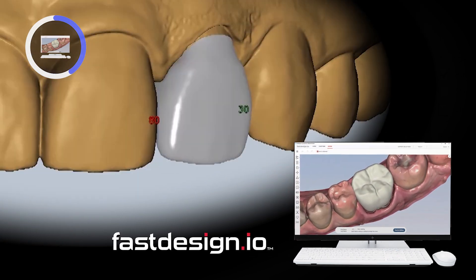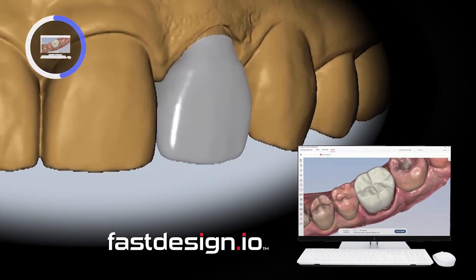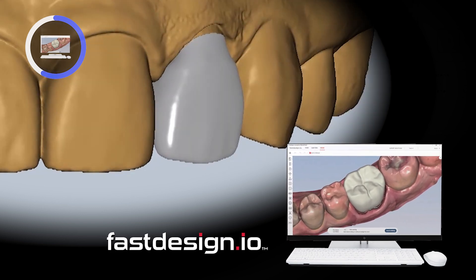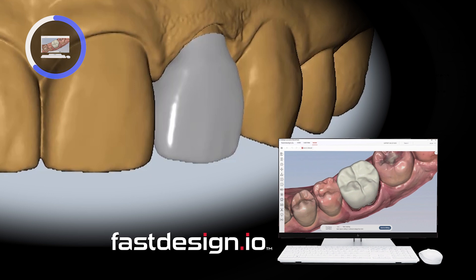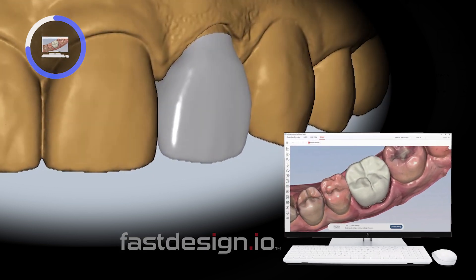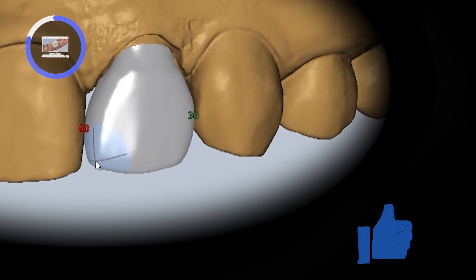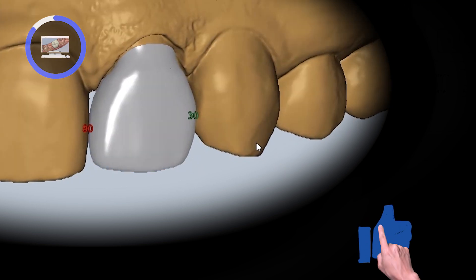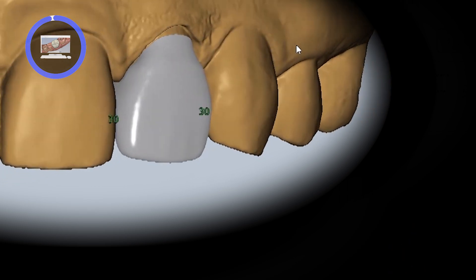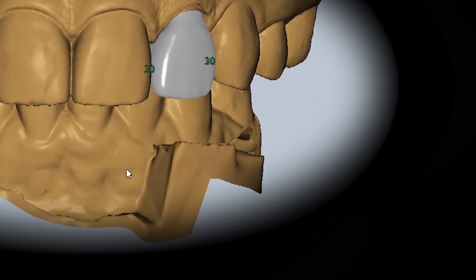Once the margins are placed, if necessary, it's easy to modify the margins by dragging the line around. Once the margins are completed, both restorations can be designed simultaneously. Here I'm using a tool called Freeform that can allow custom adjustments to any area of the design. Once the design is complete, I'll automatically set the proximal contact values using the Edit Contacts window here on the right.